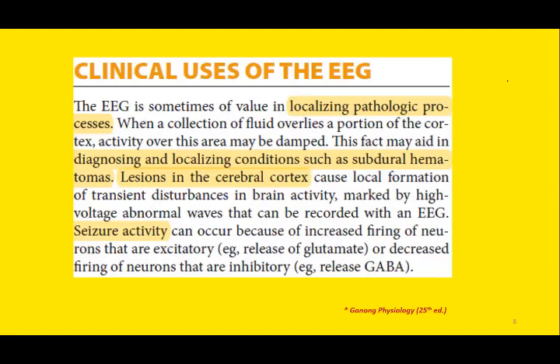What is the clinical significance? So, what is EEG? Electroencephalography, as the name indicates, is the graphical representation of all the electrical activities which are occurring in the brain. And these electrical events are represented on a graph paper, and the paper is known as electroencephalogram.